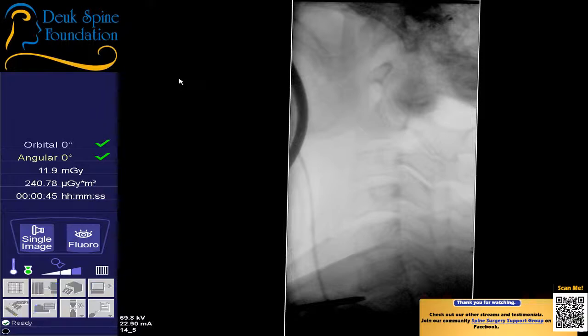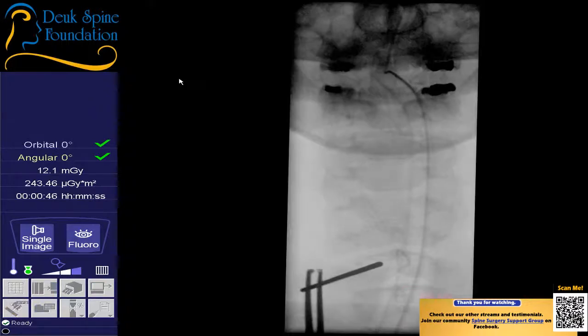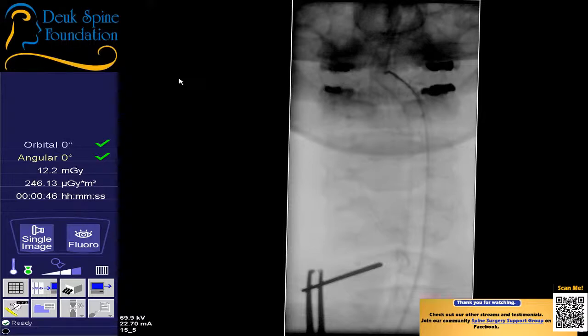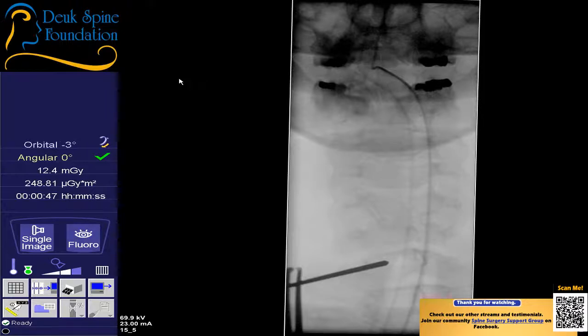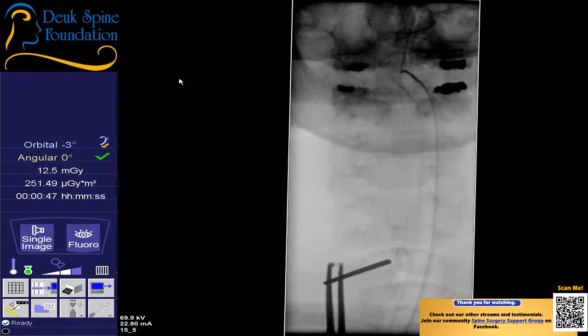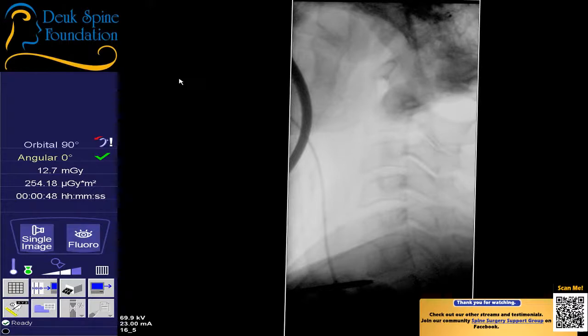Give me a good AP shot. And that's rotated. Give me a good AP. Yeah, bring it towards you quickly. And then derotate it. Go. Shot. Other way. Shot. Oh, yeah, that looks good. Go back to a lateral now. Almost done, guys. Just hang in there. 15 seconds. Lateral shot. Shot. Very good. Everyone relax for a moment.